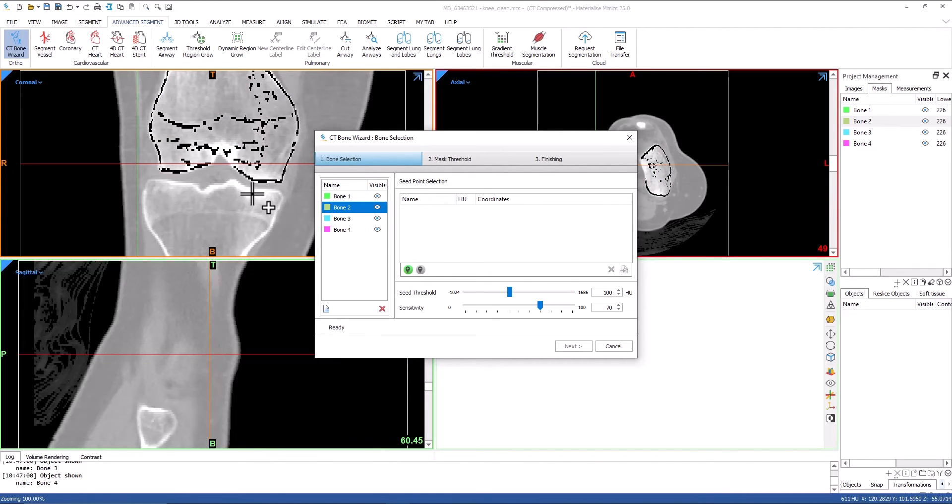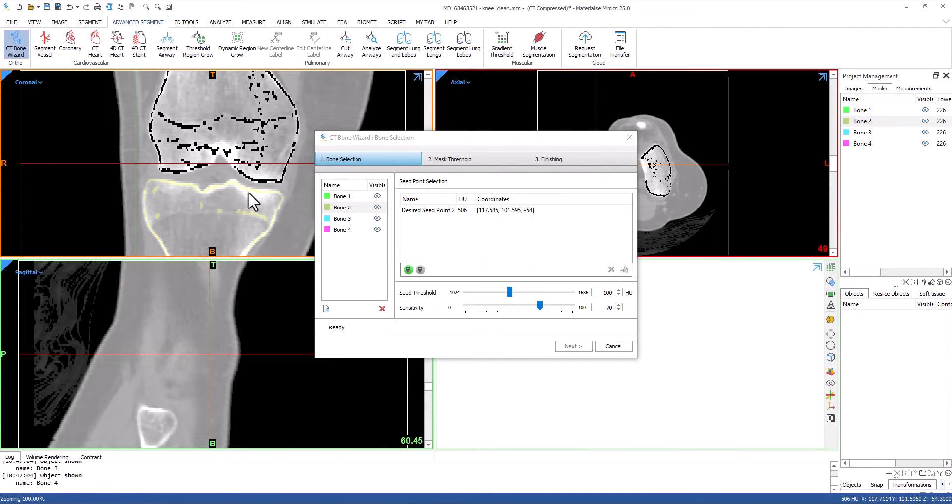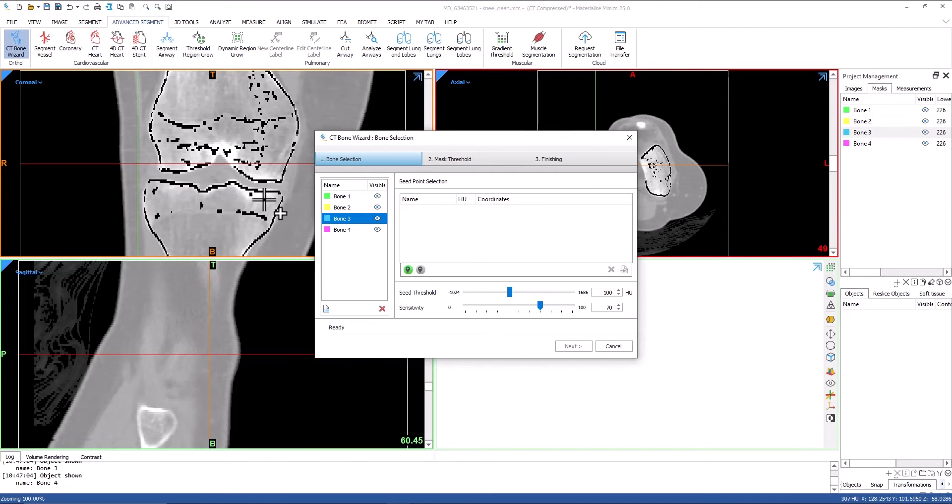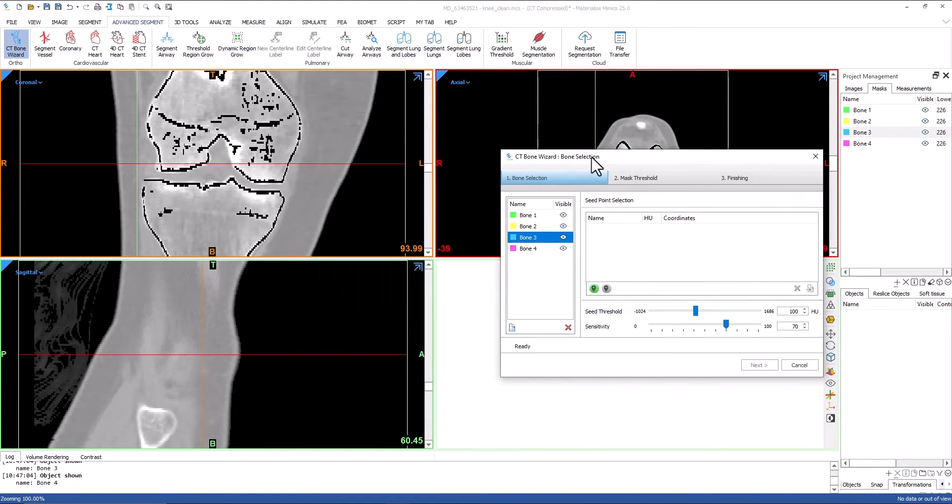As I progress through setting my seed points, you'll notice that the previous bone's seed points turn black. This indicates that these seed points are no longer available and belong to the previous bone.